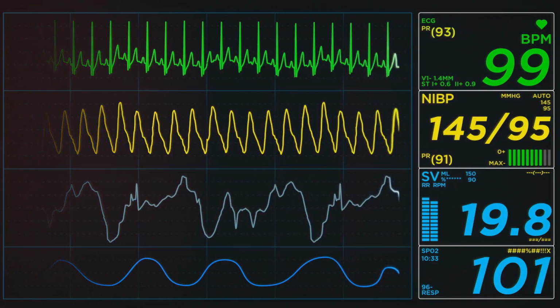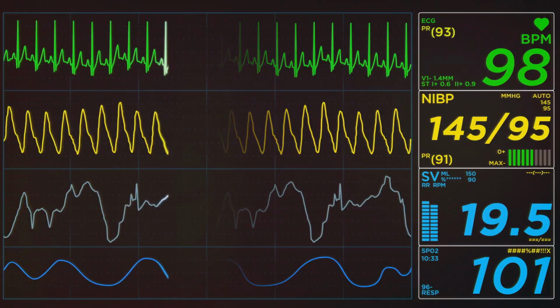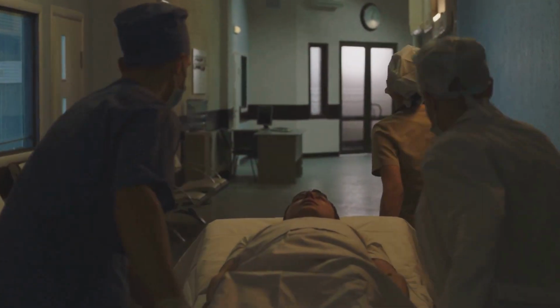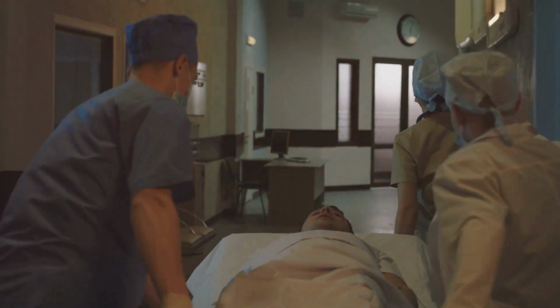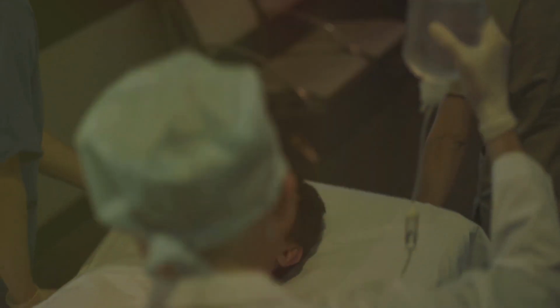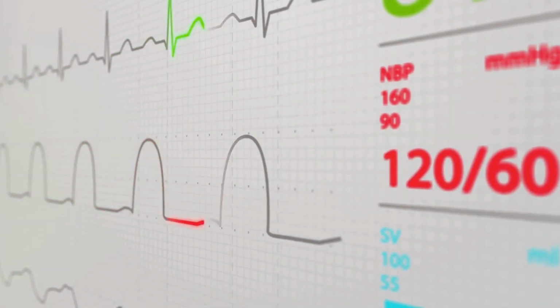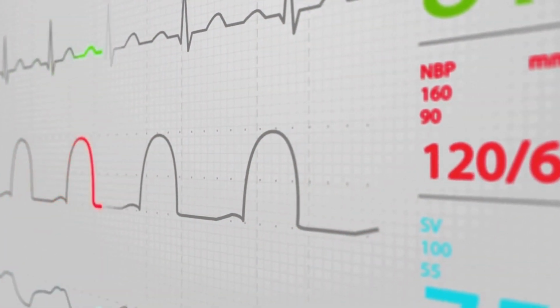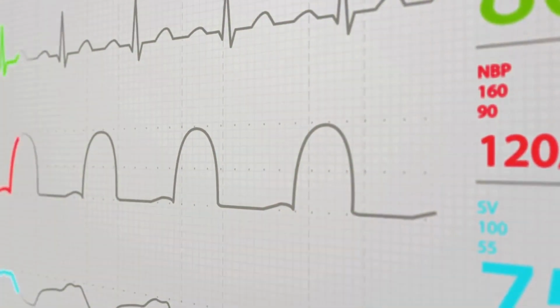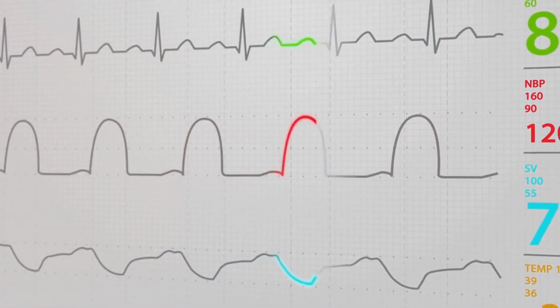This mode is particularly useful for patients who are recovering and regaining their ability to breathe independently. Last but not least, we have pressure support ventilation, also known as PSV. This mode is like having a personal cheerleader encouraging you every step of the way. PSV provides a pressure boost during the initial phase of each breath that the patient initiates. It's all about empowering the patient to breathe on their own while still offering a helping hand. This mode is often used in combination with SIMV to assist patients as they transition off mechanical ventilation.